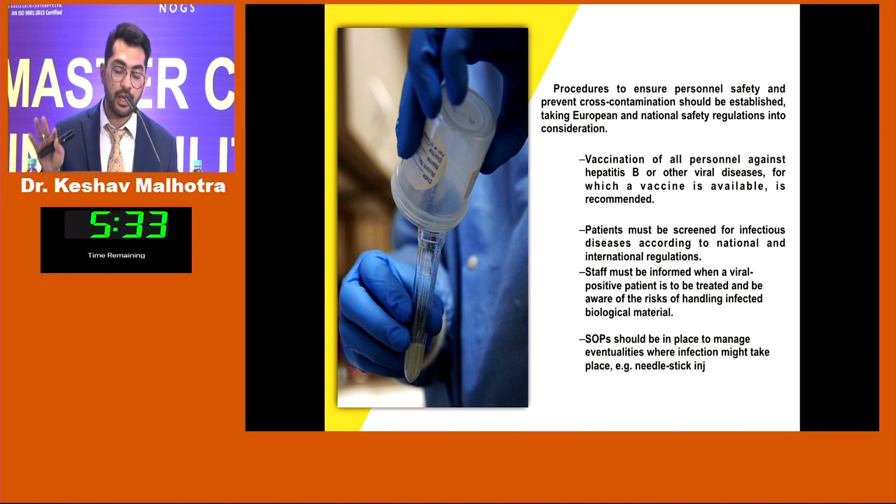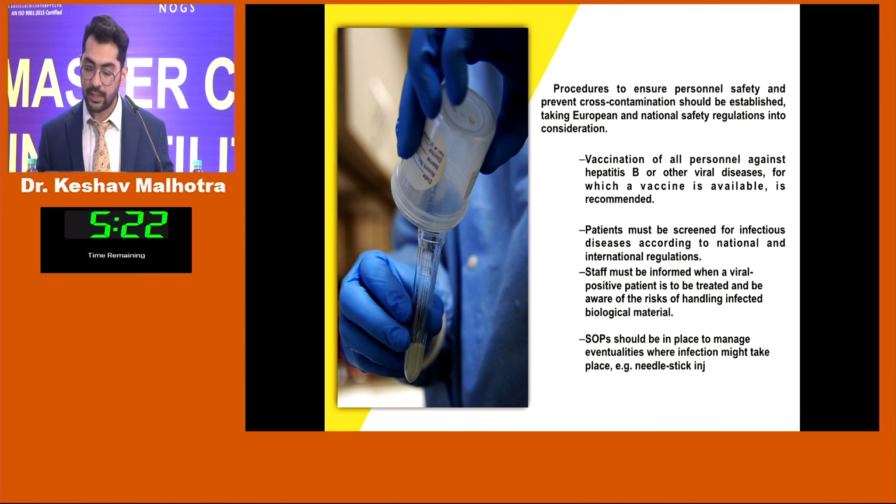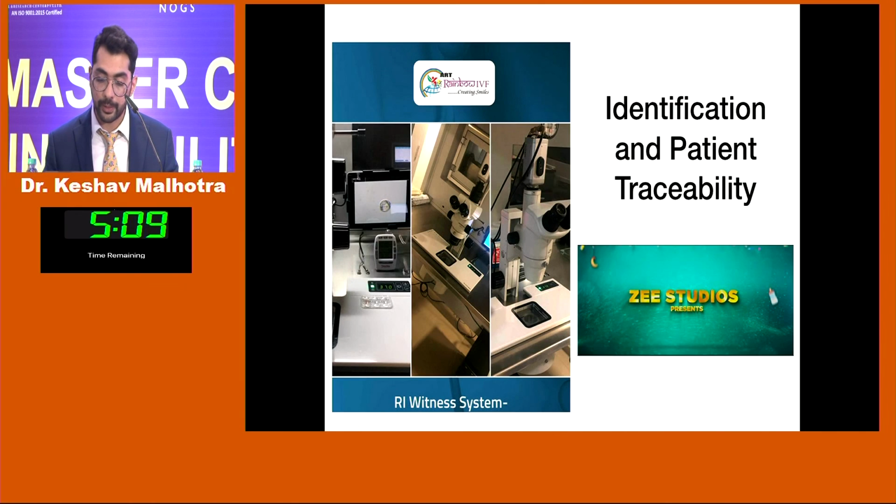and that's something that we now need to look after, because most of the patients that will come to you, these are viruses which are now getting very common. Most of the patients will come to you with Hep B, VDRL, HIV, etc. And taking precautions in such a scenario is mandatory. Also, having SOPs for managing needle stick injuries, etc., is something that you should have in your lab, and all of your staff should know about it.